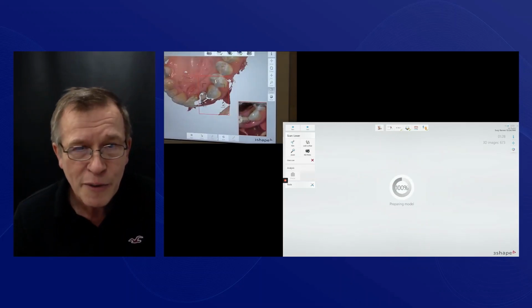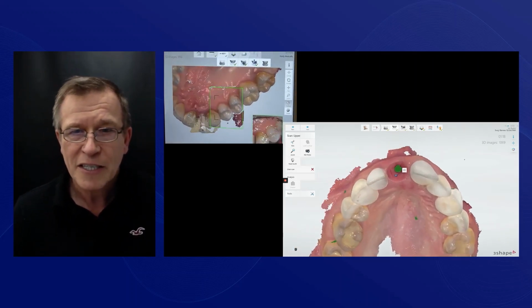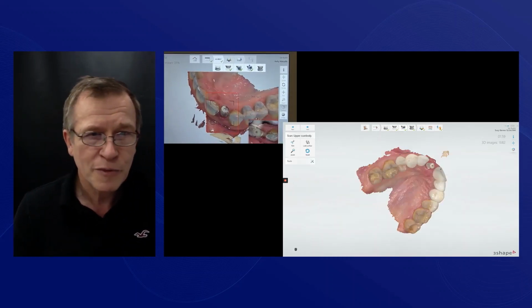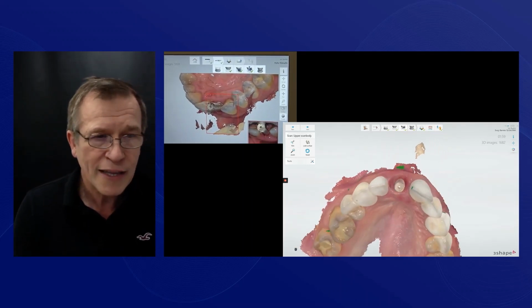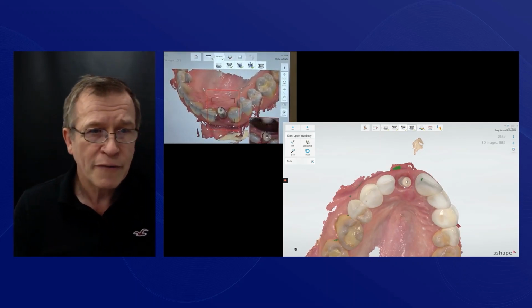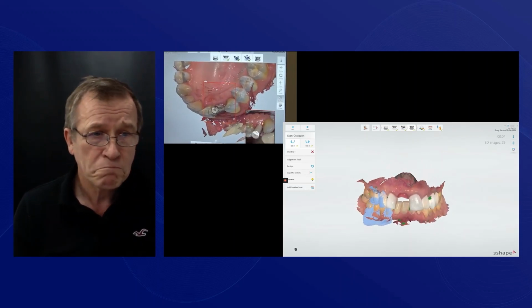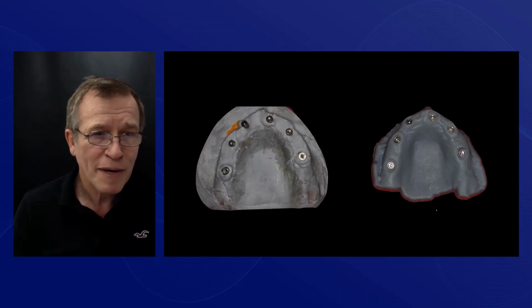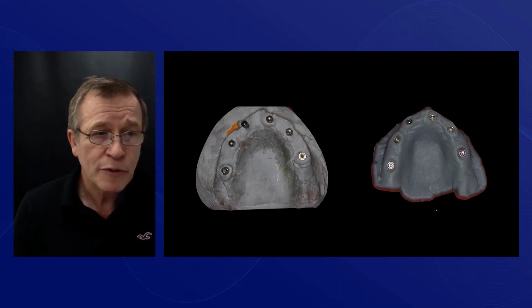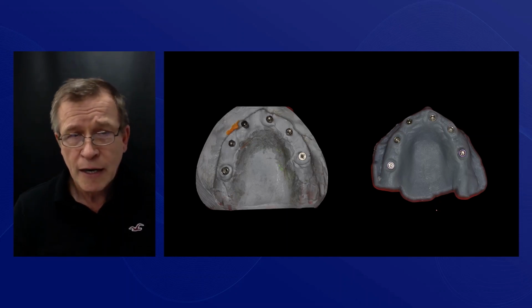This is the part I alluded to before, but it actually makes implant dentistry so easy to deal with now. And I used to sort of dread taking these impressions. Now the patient comes in, we take the temporary off or we take the cover screw off and we scan the emergence profile. We mark where that is, and then we put the scan body in. And all we have to do then is scan the scan body, take the bite registration, and the implants come back. I screw them in, and I almost feel like a little bit of a fraud because it's so easy. Again, you need to know what you're doing. The lab needs to be a great lab to be able to do that, but there's plenty of those out there now.